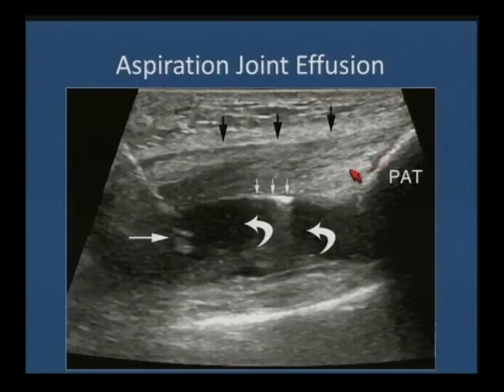And it's not uncommon for us to be asked in our practice to aspirate joint effusions. And what scenario would that be in? Typically in two or three scenarios. Sometimes the question is, does the patient have crystalline disease of some kind? Could we please tap the joint?